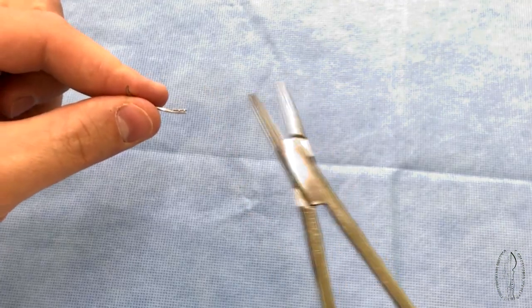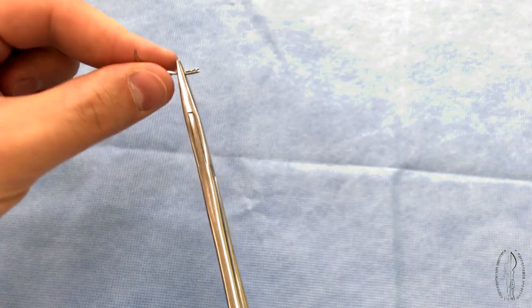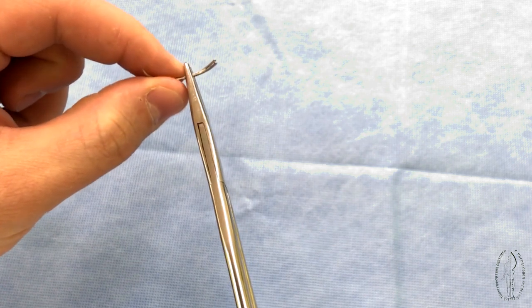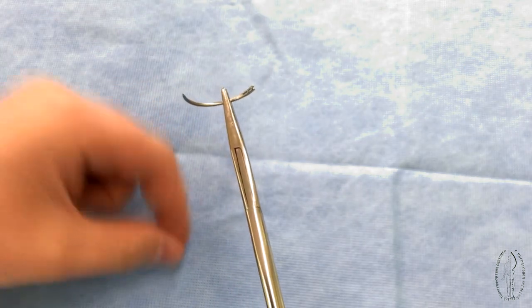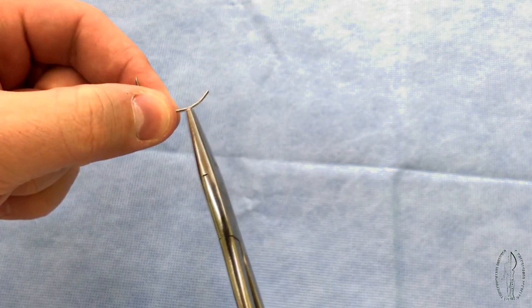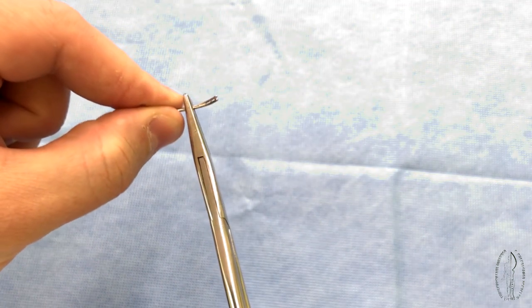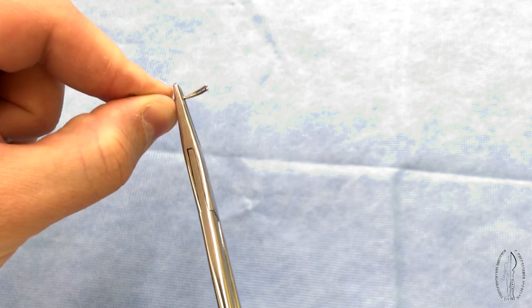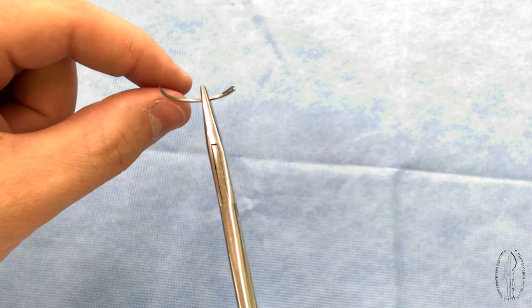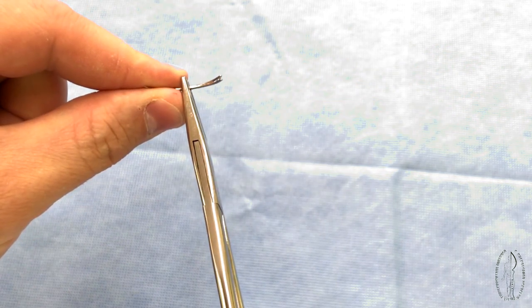A needle, branches of a needle holder, and a filament for a simple interrupted suture are divided into three equal parts. The needle is fixed into the needle holder so that one third of its length should be directed to the eye and two thirds to its tip. These proportions will allow evacuating the needle out of the tissues, fixing it, and reducing the probability of its breakage.